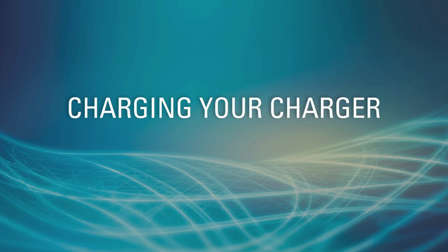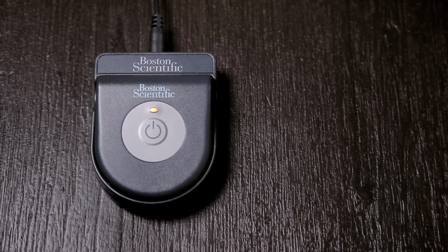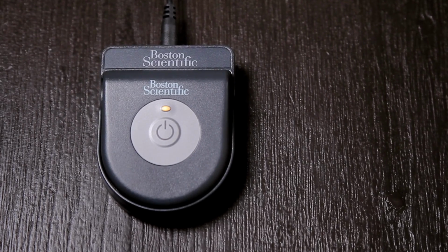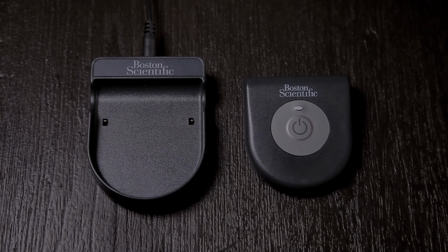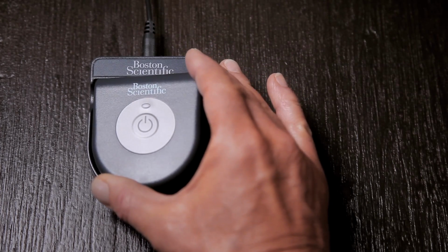Charging your charger. Your Boston Scientific Stimulator is powered by a rechargeable battery and can be recharged by the charging system that comes with it. The charging system consists of a power supply, a base station, and the charger. The charger needs to be charged in the base station before it can be used to charge the stimulator.